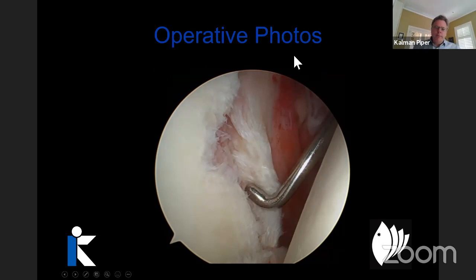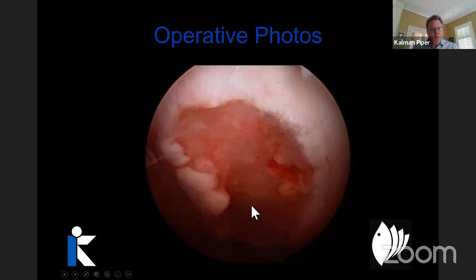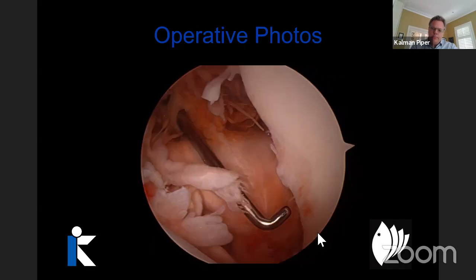Just a couple of quick operative photos. I think this is again covered by previous talks. This is a fairly straightforward labral tear. This is perhaps one that I would consider repairing arthroscopically, but this patient has a large Hill-Sachs fracture. So all of a sudden, thinking perhaps this should be a Latarjet procedure or something to address the bone anatomy as well as the soft tissue pathology.